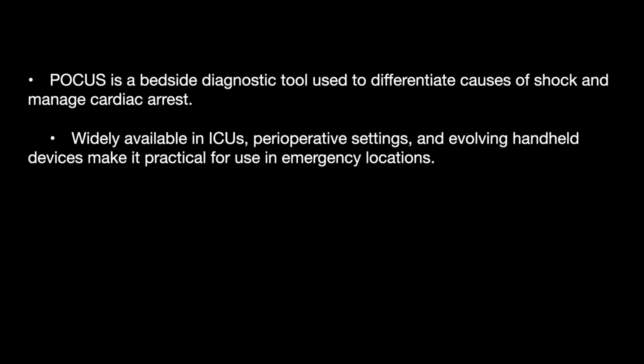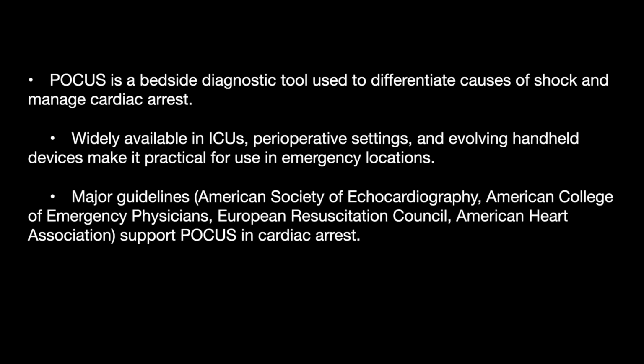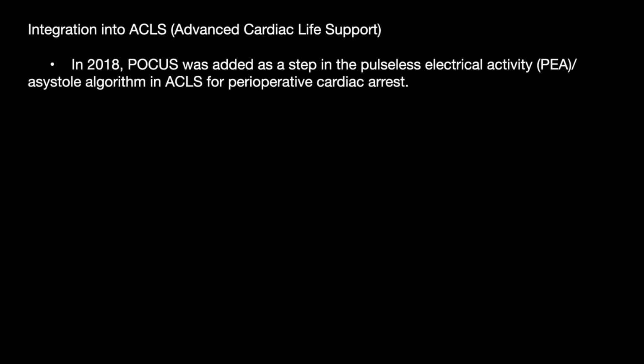It is widely available in the ICUs and perioperative settings, and involves handheld devices, making it practical to use in emergency locations also. Various guidelines have been published by various societies which support the use of POCUS in cardiac arrest. However, clinicians must avoid pauses of longer than 10 seconds in chest compressions while using ultrasound. It is also integrated in the ACLS.